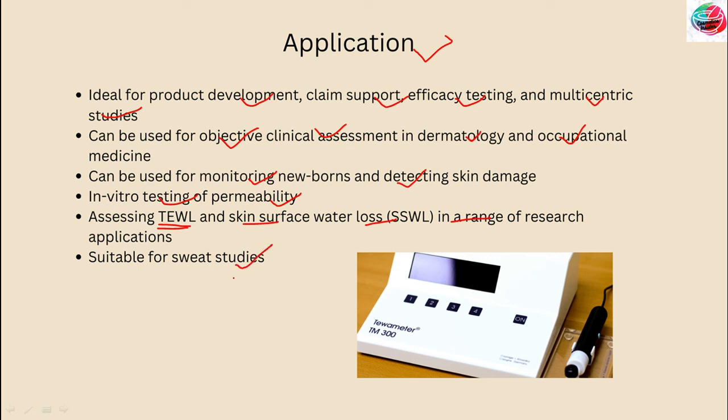So this is the transepidermal water loss instrument, which is called the TEWAmeter. In the next session, we will see another instrument or another research.